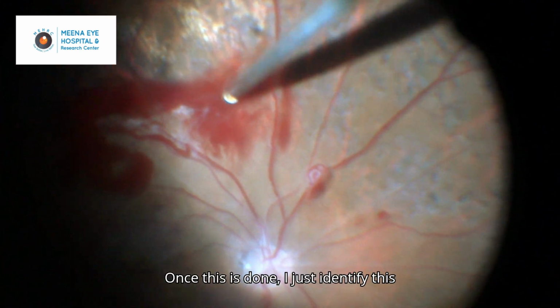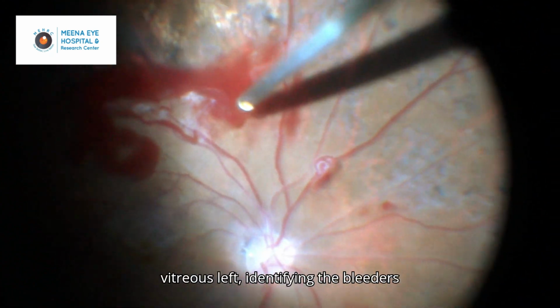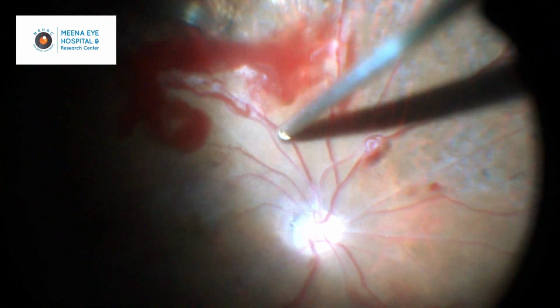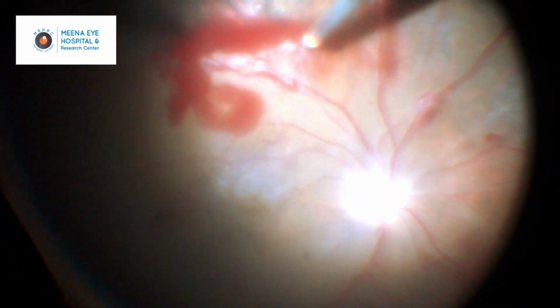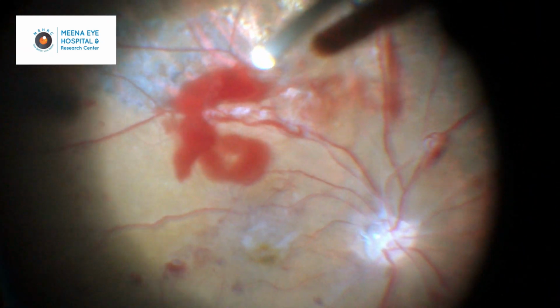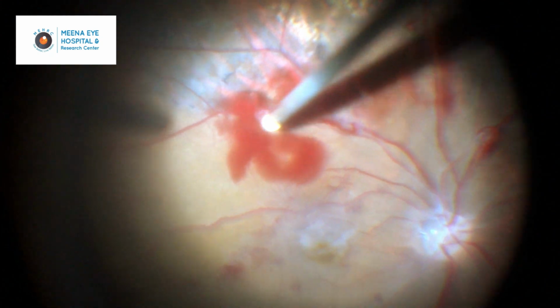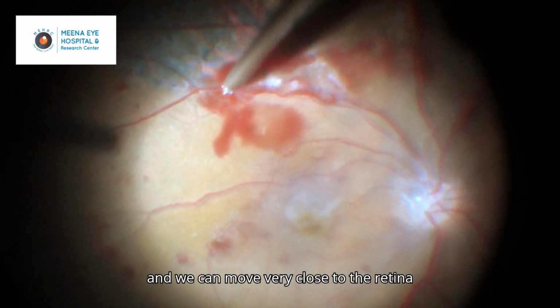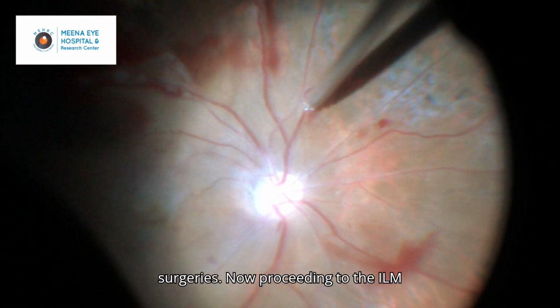Once this is done, I just identify this area where there is still vitreous left, identify the bleeders and then cauterize the bleeders. With these beveled cutters, 25 gauge by the Alcon system, we have very good control and we can move very close to the retina, and this helps immensely during such surgeries.